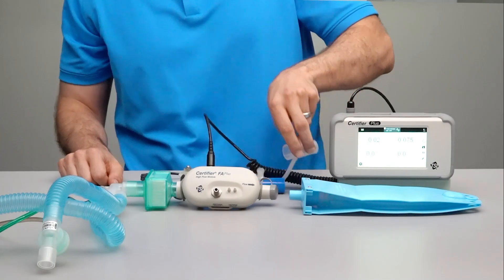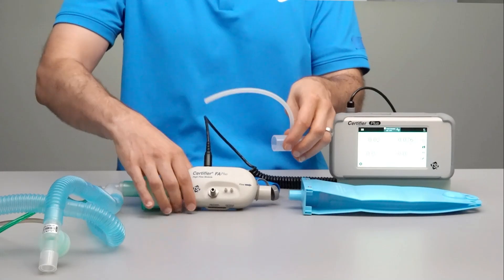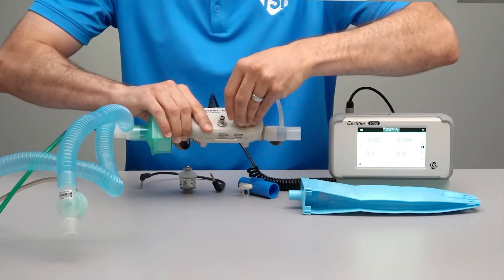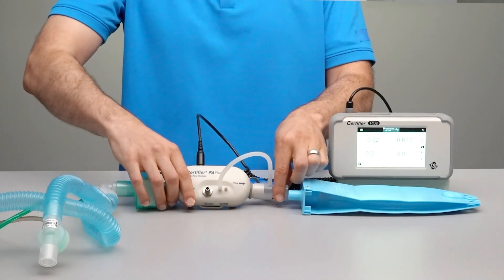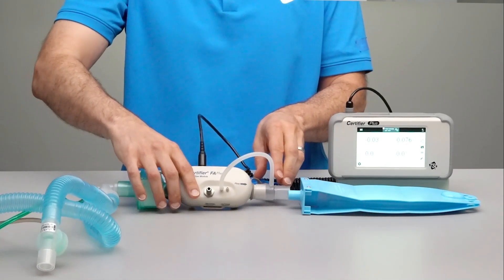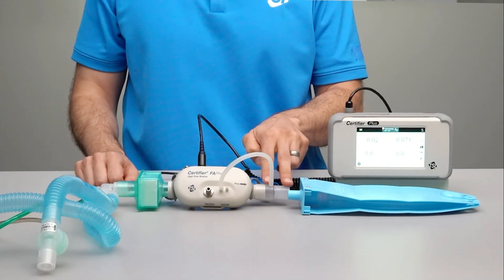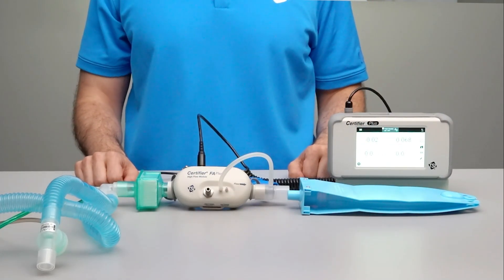To connect the low pressure measurement to the test circuit, attach the airway adapter to the outlet of the flow module and then connect a piece of tubing from the airway adapter to the positive pressure port on the flow module. Low pressure measures the difference in pressure between the positive and negative ports. When used with the test lung, we recommend that the low pressure adapter be placed on the outlet of the flow module as this will help condition the flows coming back from the test lung through the Certifier.